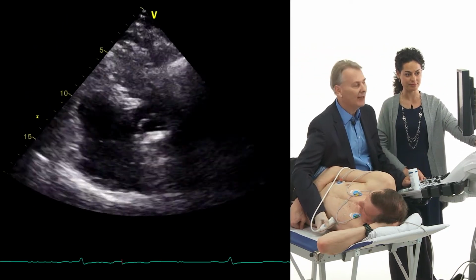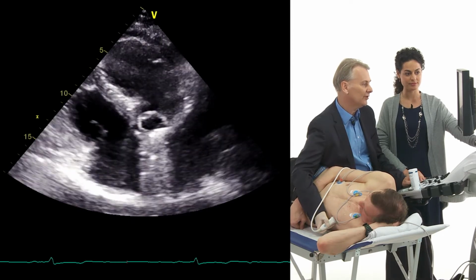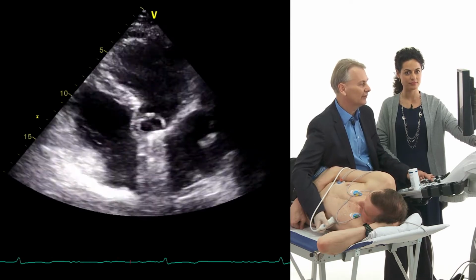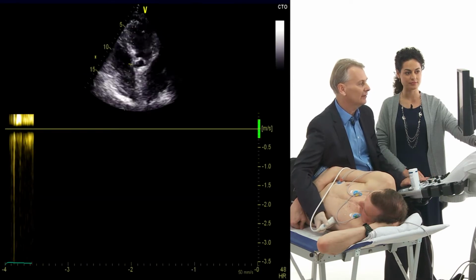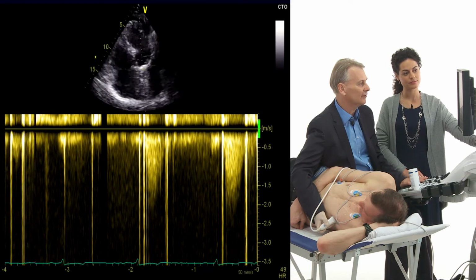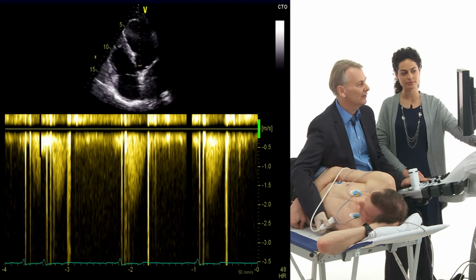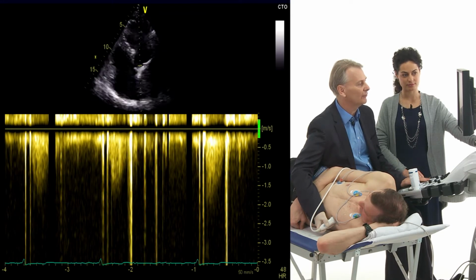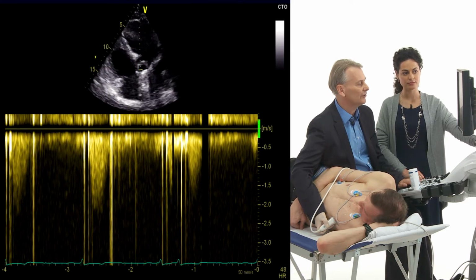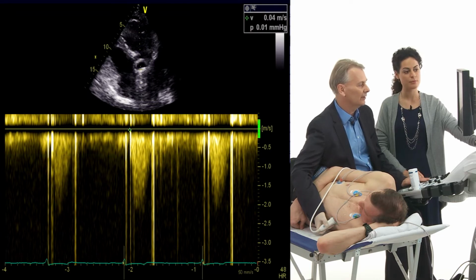Yes, and to do that, we do something that we also perform in aortic stenosis. We try to get a 5-chamber view where we have a good orientation between the flow of blood through the aortic annulus, in this case the prosthesis, then place a continuous wave Doppler spectrum inside, see that we have the sample volume or the focal point right at the region of the prosthesis, and then we freeze the image and quantify the signal.